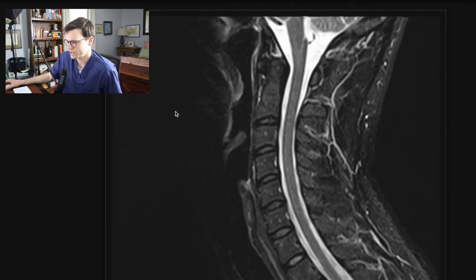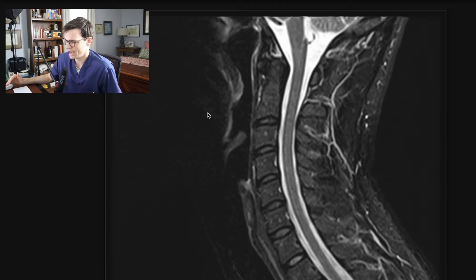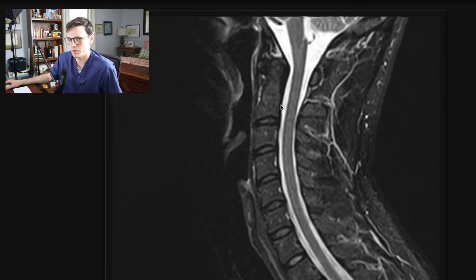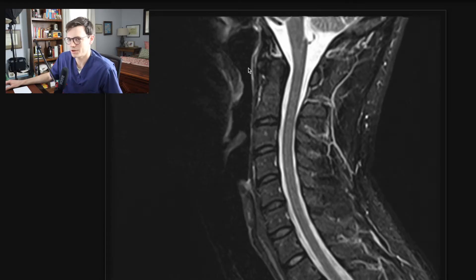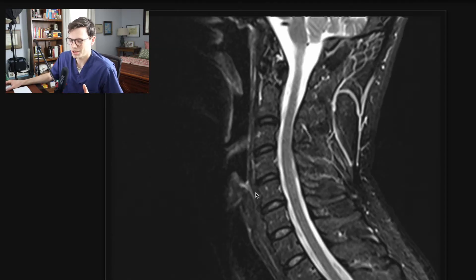What I have here now is the STIR sequence. I really like the STIR sequence — it's a very useful sequence to spend a lot of time on. The STIR sequence is very sensitive for identifying different types of pathology, and generally pathology shows up as bright. So if you see brightness within a bone, think fracture, think tumor, think some sort of lesion. You can look for brightness within the prevertebral space, such as prevertebral edema in trauma. The STIR sequence is also great at looking at all the ligaments — this is your sequence to look for ligamentous injury, where you'll see hyperintensity within the ligaments.